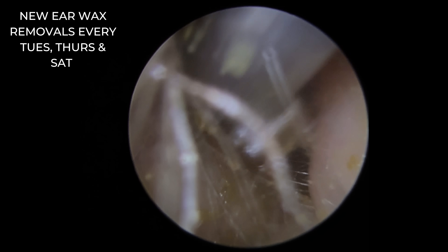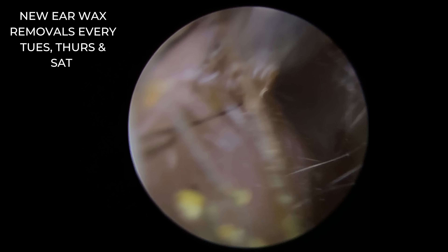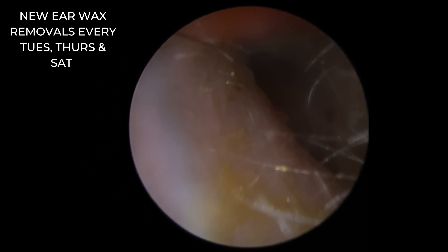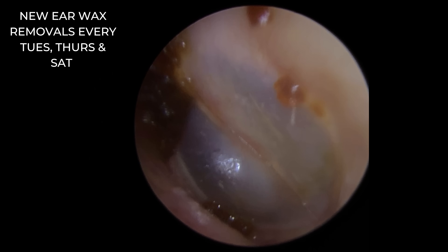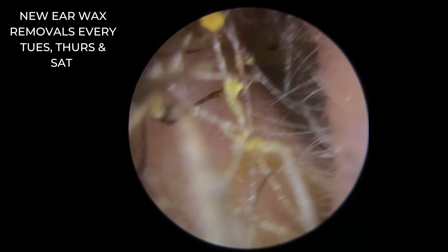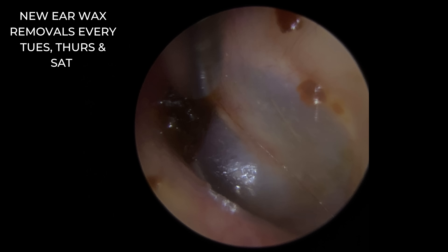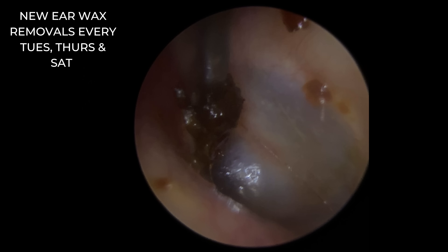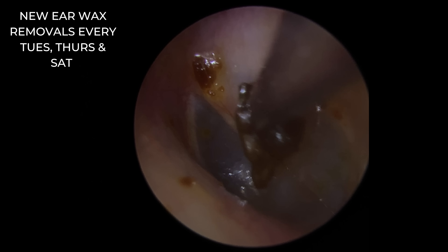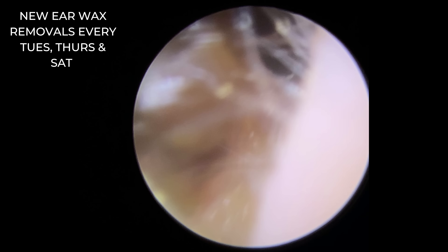We're just coming to the end of this wax removal now, just taking these looser bits that have broken off right at the entrance to the canal. There's a sneaky little bit just there — to the top left-hand corner. So we're going to switch to the fine end now. We can get that comfortably then just underneath the handle of the malleus. And pull that bit out as well — out that comes.